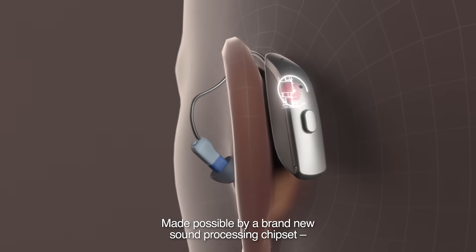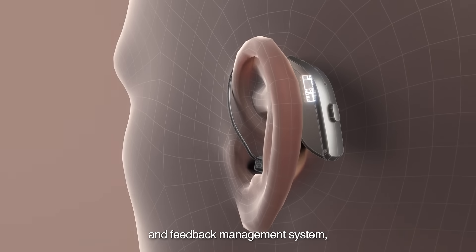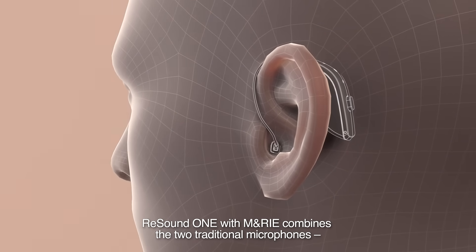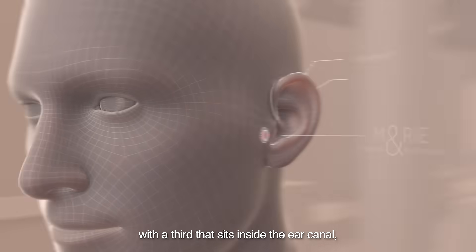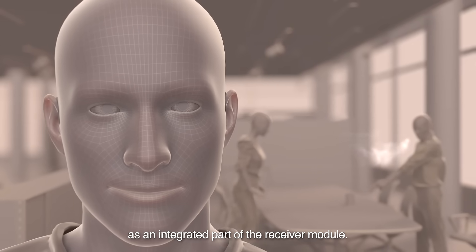Made possible by a brand new sound processing chipset and feedback management system, it's a major advancement in technology. ReSound One with M&RIE combines the two traditional microphones with a third that sits inside the ear canal as an integrated part of the receiver module.